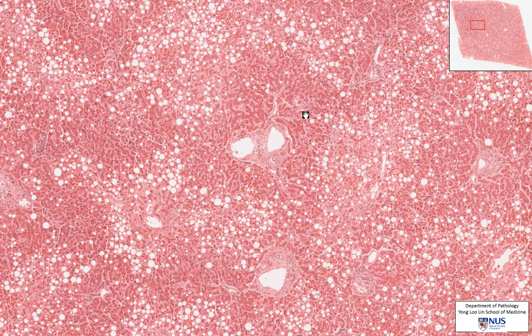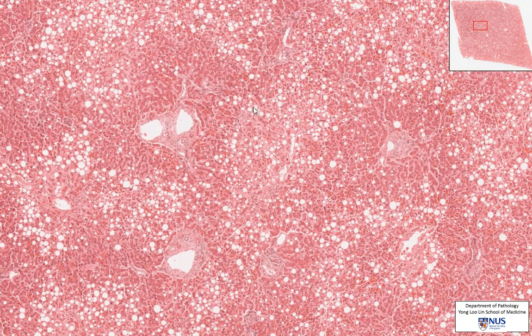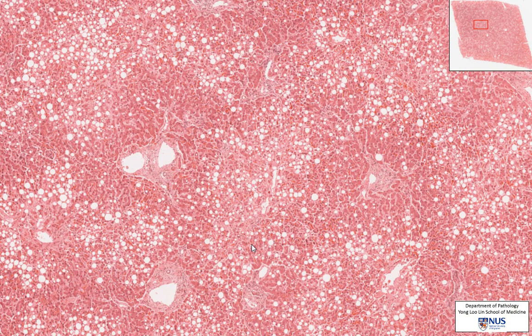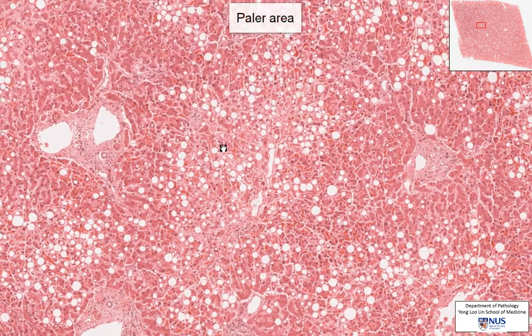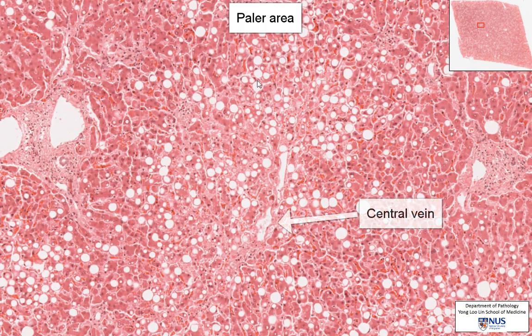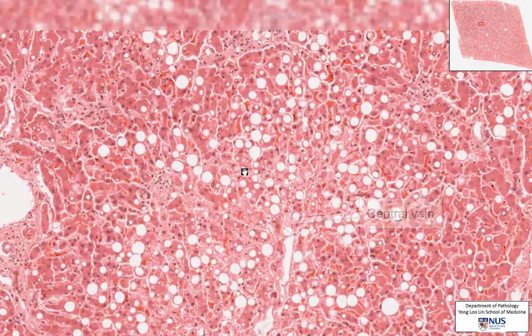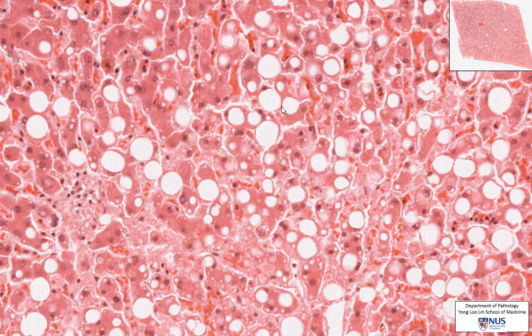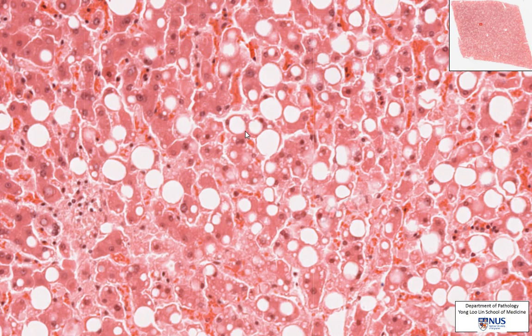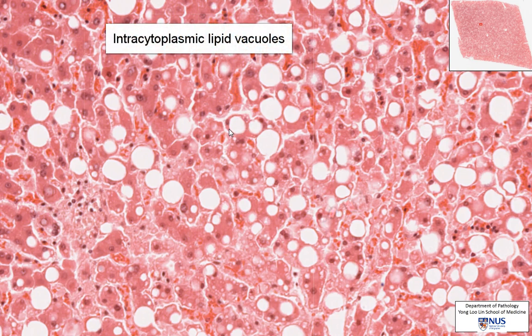Now let's zoom out and look at a pale area. Just adjacent to this, over here, there is a pale area. The reason why it is pale is because there are many of these empty appearing rounded holes. These holes actually used to contain lipid, and they are located within individual hepatocytes. You can see here that this specific hepatocyte is expanded by this rounded lipid vacuole.